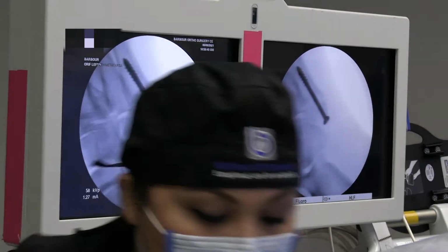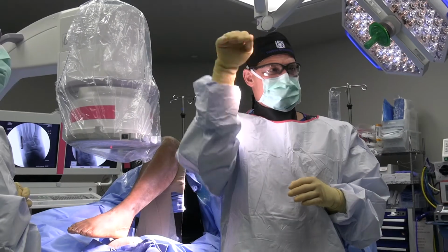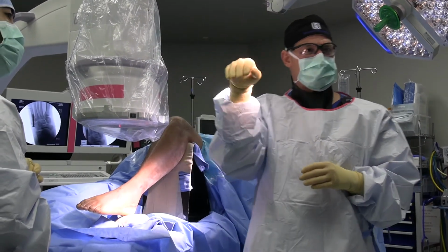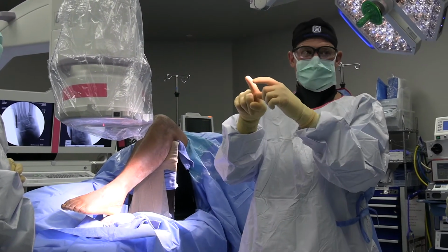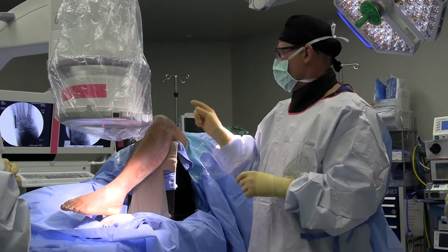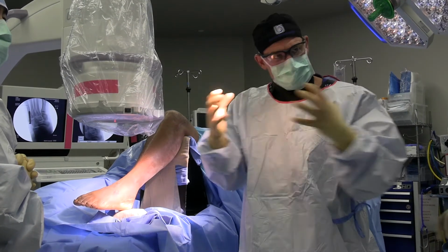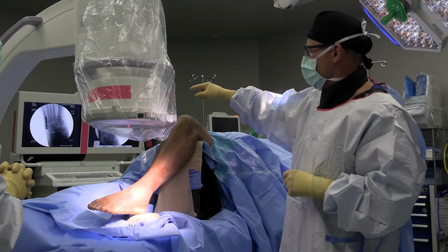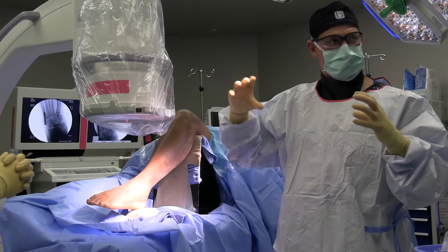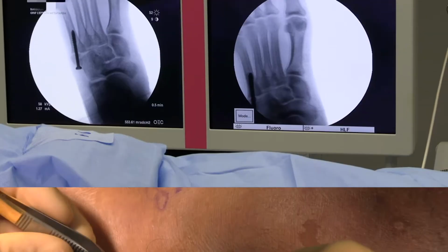Take an AP. People have different bows to their metatarsals, so a straight screw at some point is not going to work. So I want it long enough that the threads get across the fracture site so they'll bite and compress. And that's compressed now. The screw is tight. Okay, so now we're just going to.